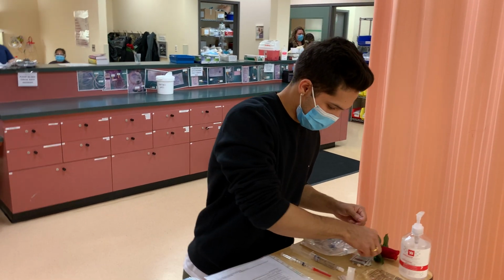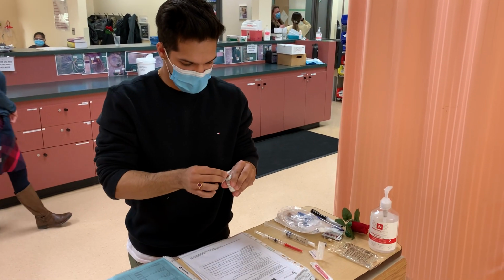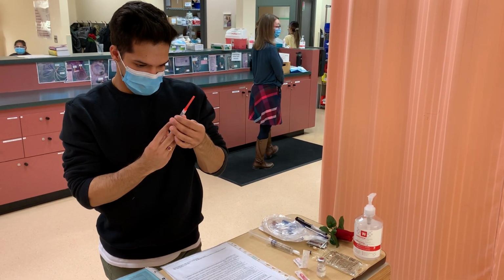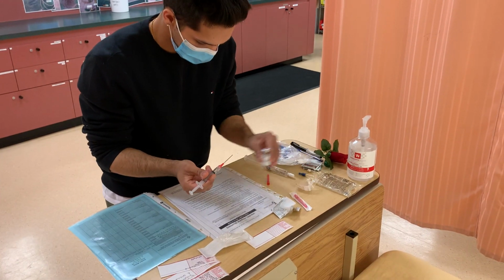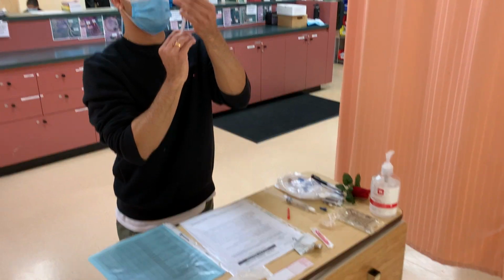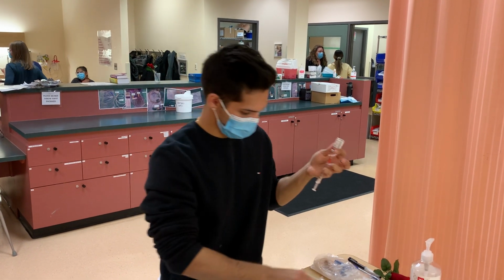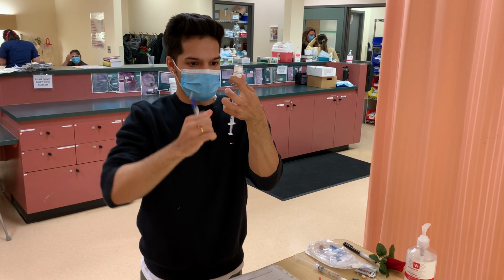Okay, now I'm just going to be wiping the top of my vial. Rubbing it for 30 seconds, letting it dry for 15, and for demo's sake, I'm going to pretend that's been 15 seconds. Okay. And then I've also made my label that's going to go on my minibag. And then once I'm after 2 minutes, so now that I've done that, I draw my medication.